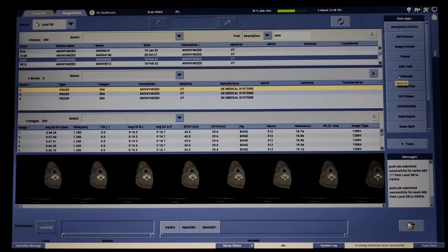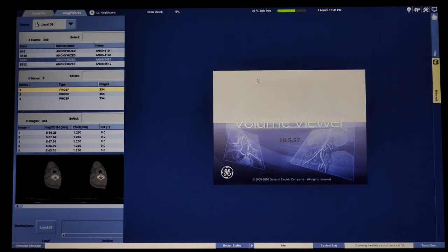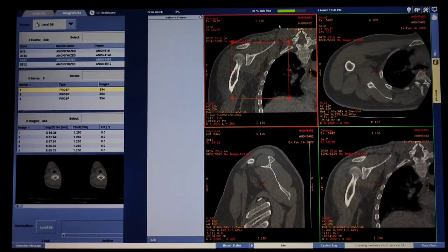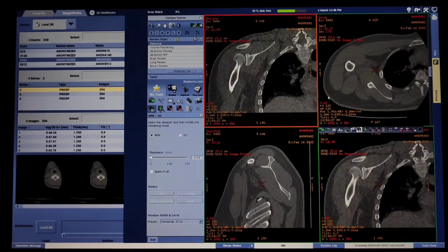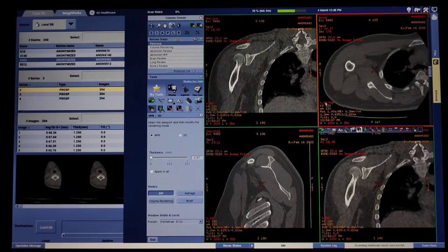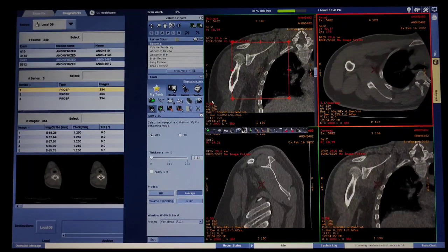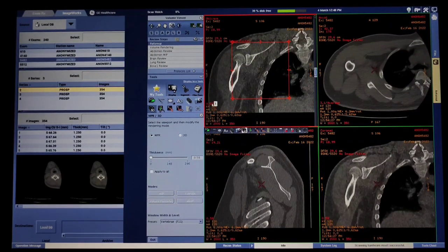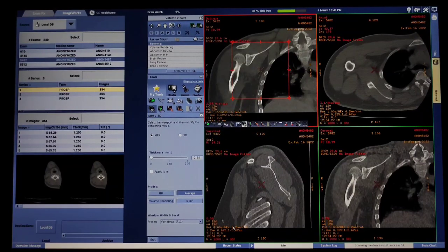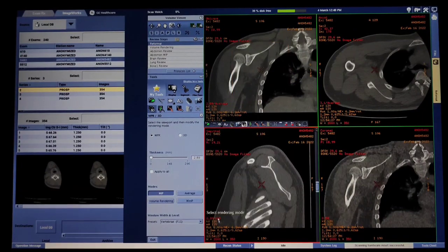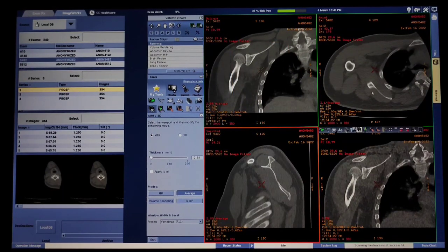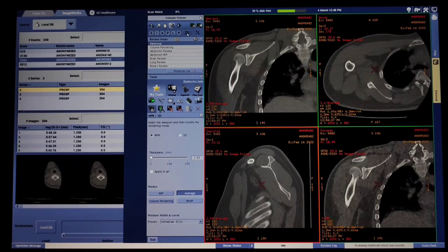We have to select bone window, then we have to select Reformat. After Reformat, we have to select 3mm average. Then axial, coronal, sagittal — 3mm windows. Then we have to select 3mm average and multi-obliques.